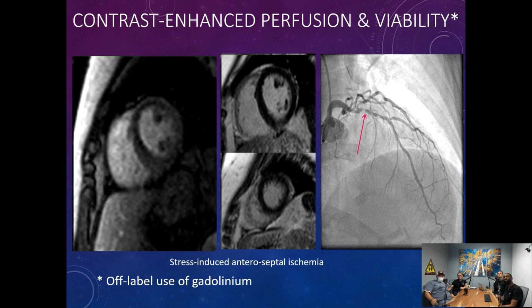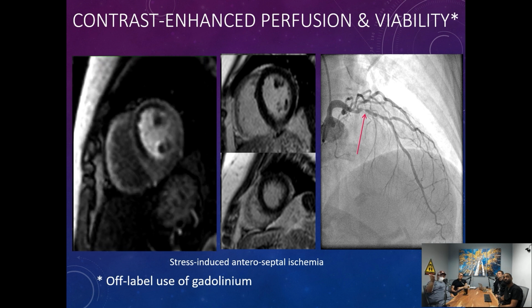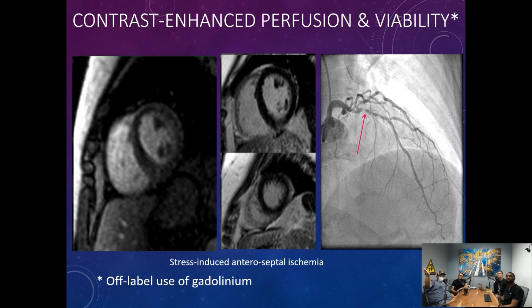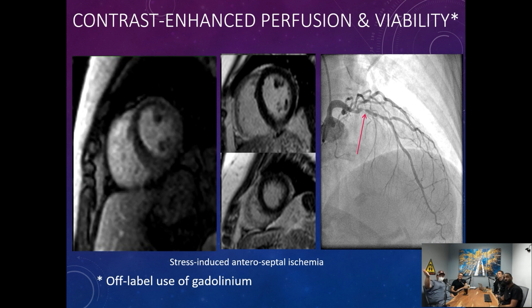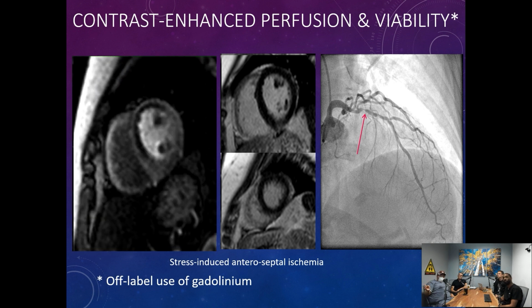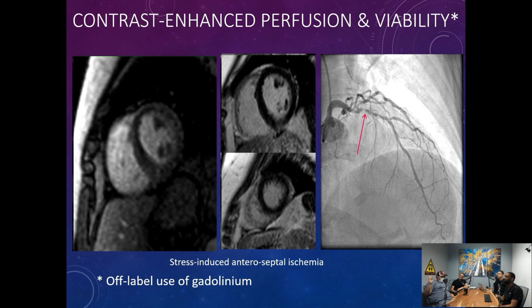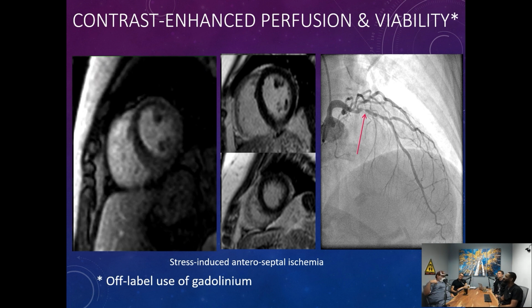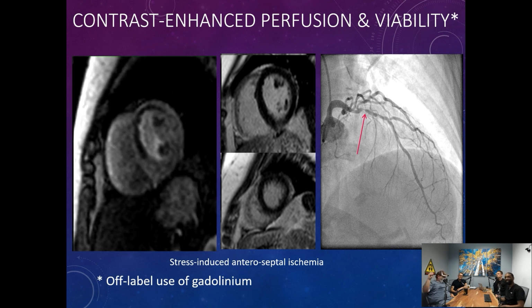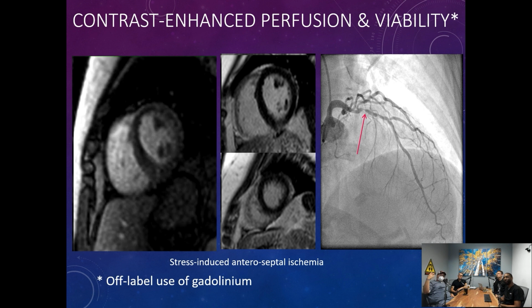Sure. And the thing that you'll see here is the myocardium enhances. When we talk about delayed imaging, we don't mention it, but this is an inversion recovery sequence, where one of the things that's really important to get good delayed imaging is we want to take normal heart and make it black. So if there's any abnormal heart, it stands out. It's easier to see gray on a black background than it is to see white on a gray background.